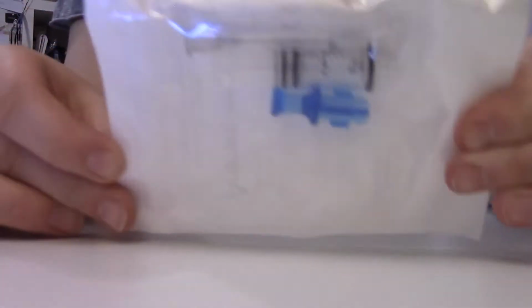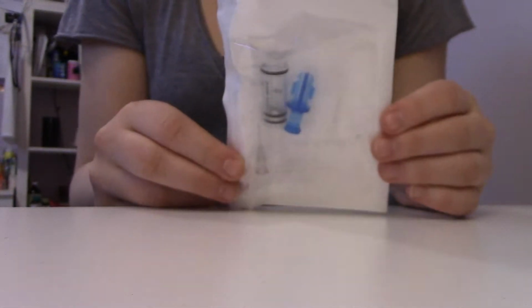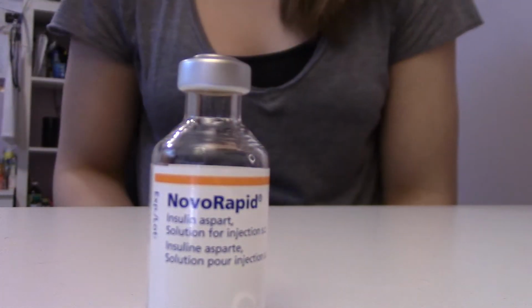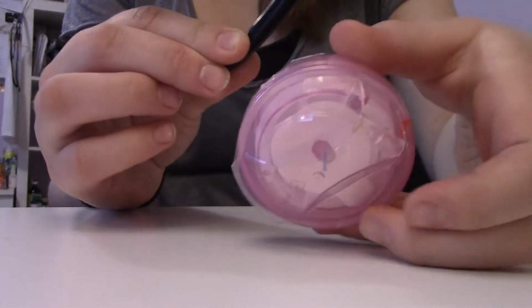You're also going to need your cartridge. So mine's just this basic one, and it comes in a package like this. You're going to need insulin. So I use the NovoRapid, and that's what I'm going to be using in this video today. And if you have one, just to help save the environment, I have these awesome little mini pliers that I use to pull the needle out of my insertion site. That way I can just recycle the rest of the plastic.